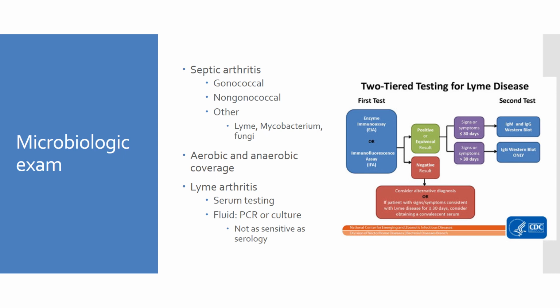And so you do have to be able to screen the joints. It's not uncommon for labs to throw in a Thayer Martin or something like that on a synovial fluid. Staph aureus is still more commonly isolated, just sheer numbers, but that's true across the board with infections, okay? And you can see pretty much any organism, if it gets the chance to get in that joint, it will take advantage of it.